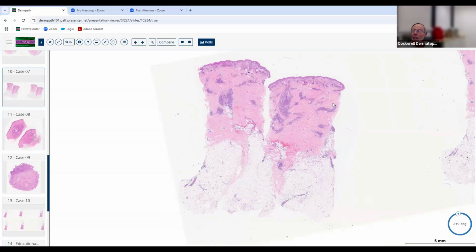And we have a mnemonic device for those. We use the letter L, and some people talk about the 5 L's. We add a few extras, and there's actually another one that you can put in there that we'll talk about in a minute as well. But it's a lymphocytic infiltrate. So at low magnification, once you've got that, the reason for making a preliminary first impression low power diagnosis is so that when you go to higher magnification, you're not all over the map.